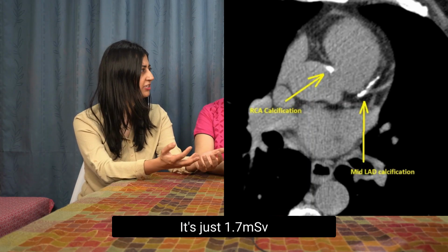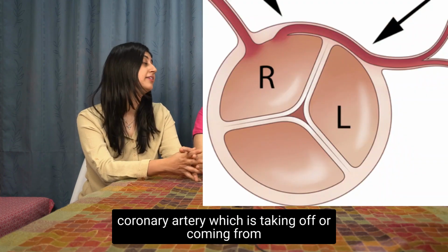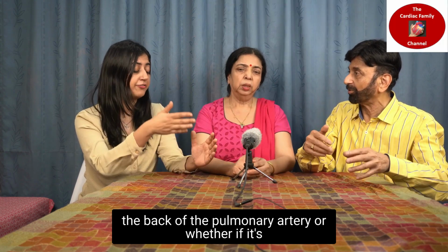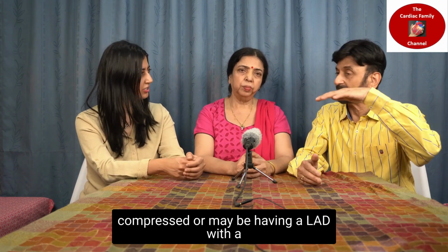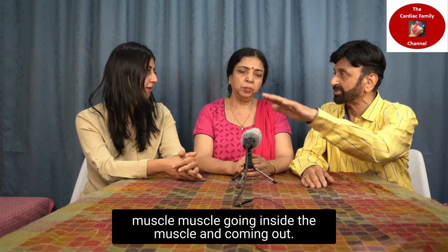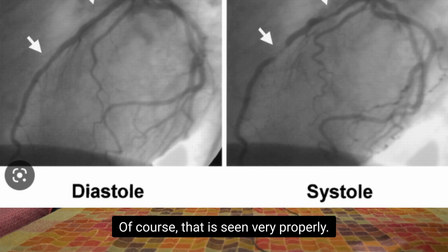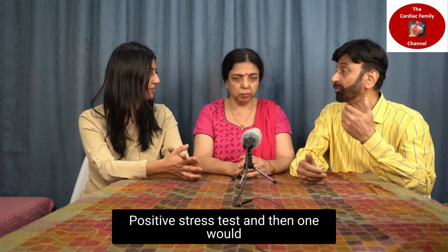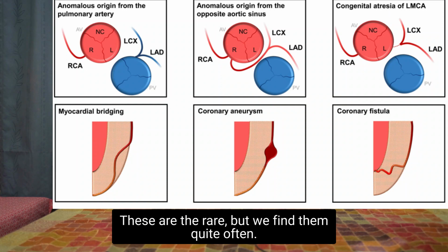It's just 1.7 millisieverts. Apart from blockages, you can identify an abnormal coronary artery anatomy, for example one coming from the back of the pulmonary artery, or going between the two arteries, the pulmonary artery and the aorta, which can get compressed. Some rarer causes include the LAD having a muscle bridge, going inside the muscle and sometimes coming out. Such coronary anomalies can give a positive stress test, and then one would think he's got a coronary blockage, but this is all a coronary anomaly.